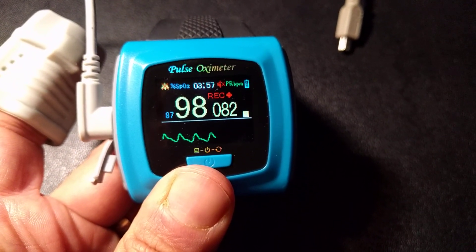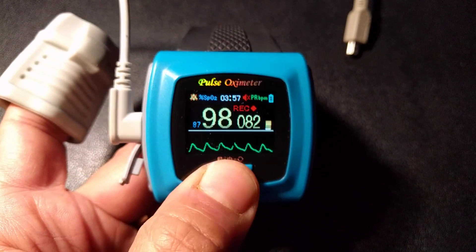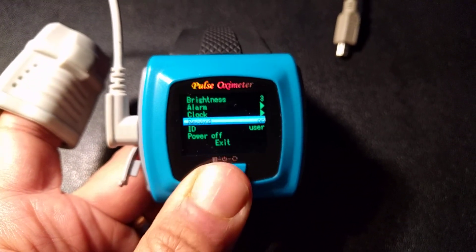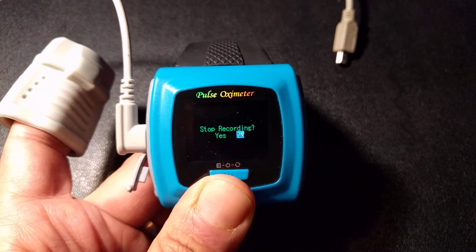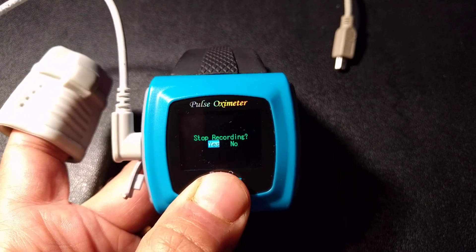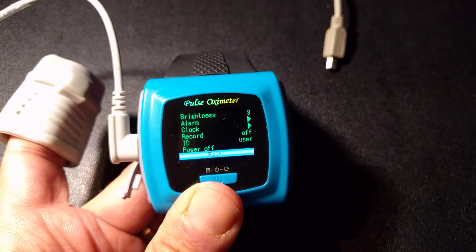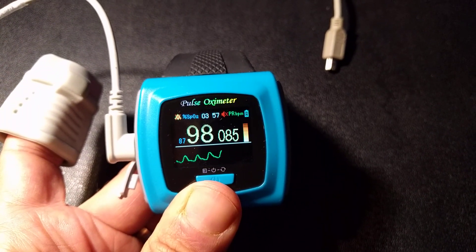Here it comes on. It's still recording — save the data, very important. Long press for menu. Go down to record, short press. It's toggling. Go down to record, long press. Select record, short press toggle yes, long press. Turn it off — the recorder is off. Toggle down to exit, long press. The recorder is off.